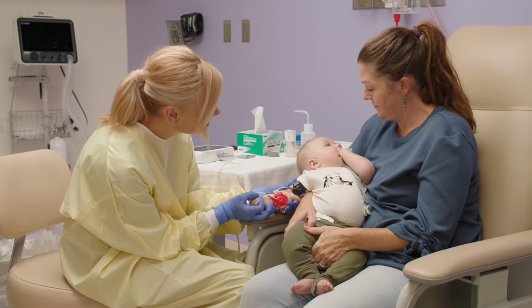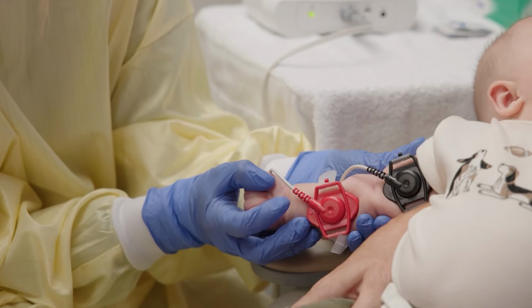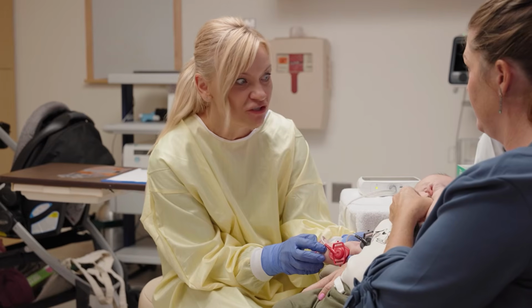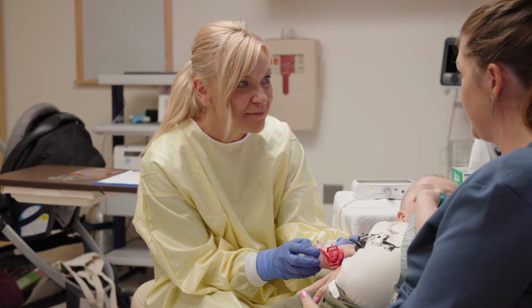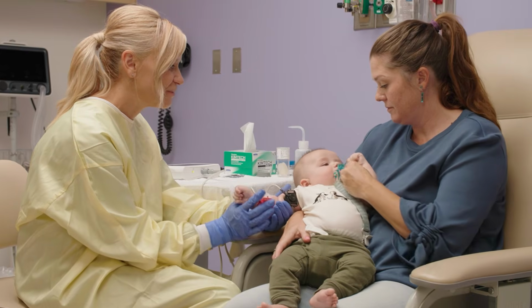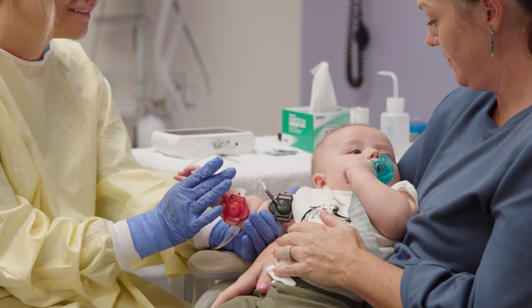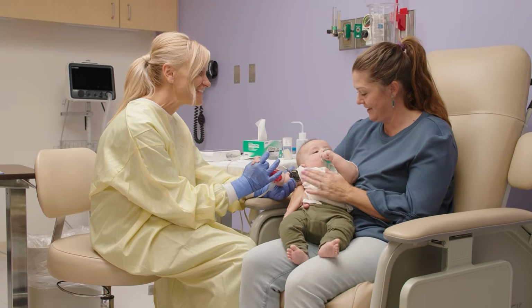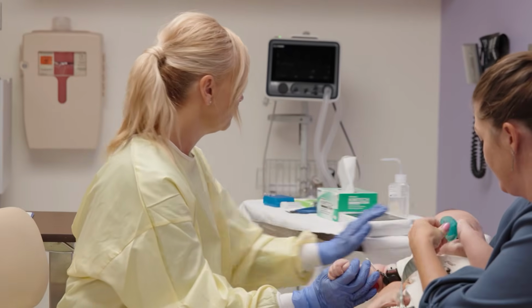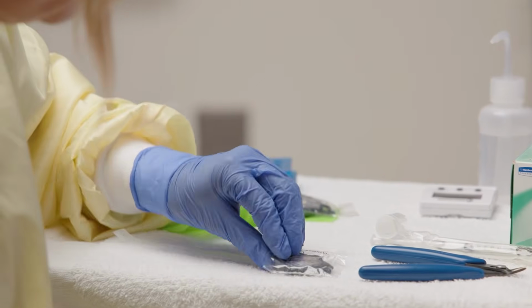During the stimulation phase, distraction is especially important for toddlers. Gently massaging the hand can help take their focus off the tingling sensation, and having a movie or show playing can also be a great way to keep them calm. Encourage the parents or guardians to bring a bottle for infants and toddlers. Feeding during the procedure not only soothes the child, but also supports proper hydration, which is essential for an effective sweat collection. Use this time to organize your collection supplies and prepare any supplies that you haven't already prepared.